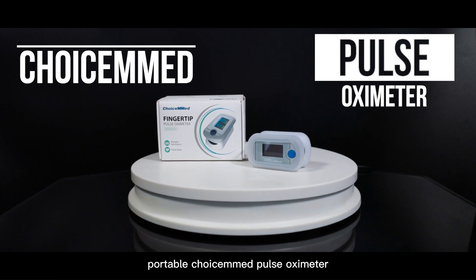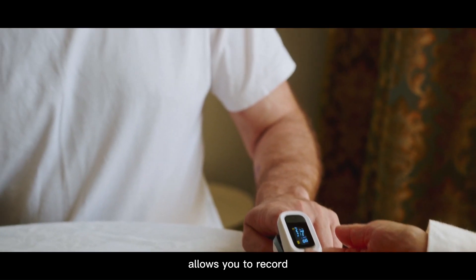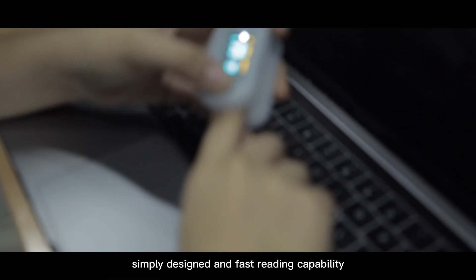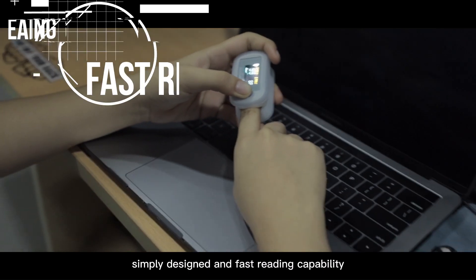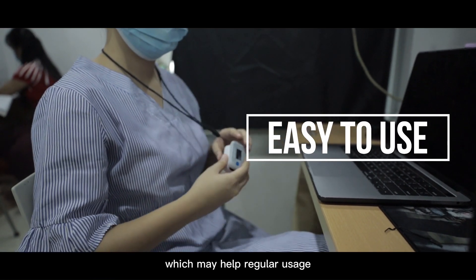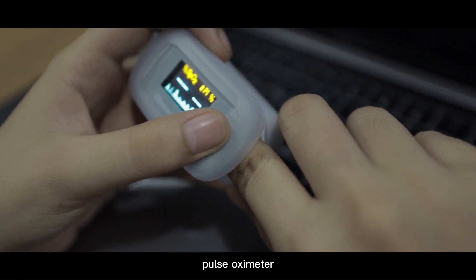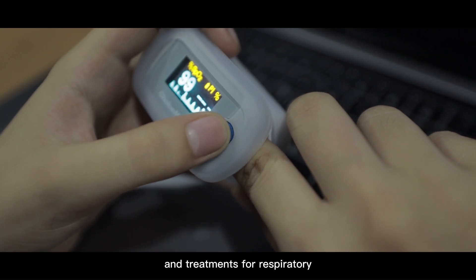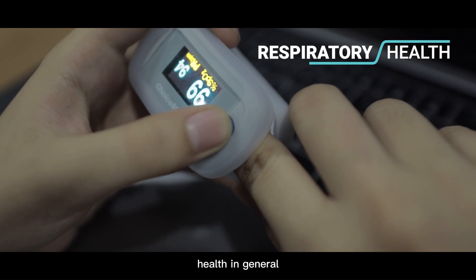Affordable ChoiceMed Pulse Oximeters allow you to record your SpO2 at home or on the go. The ChoiceMed Pulse Oximeter's simply designed and fast-reading capability makes the product quick and easy to use, which may help regular usage. Pulse Oximeters can help you proactively monitor symptoms and treatments for respiratory health in general.